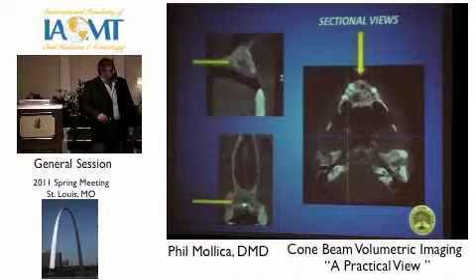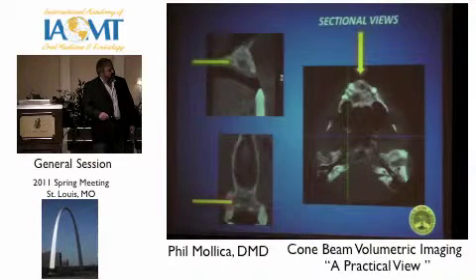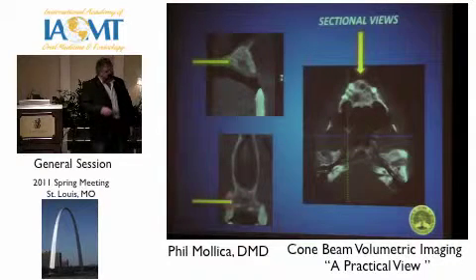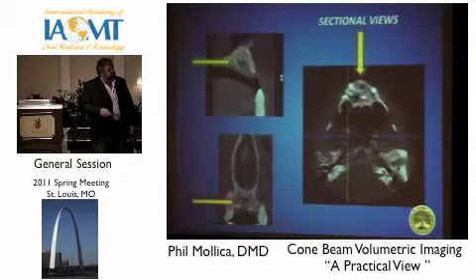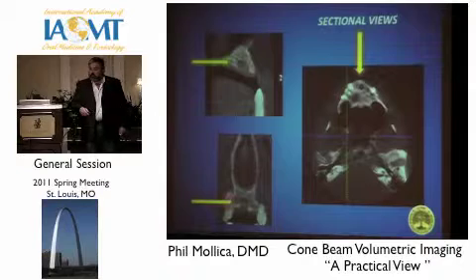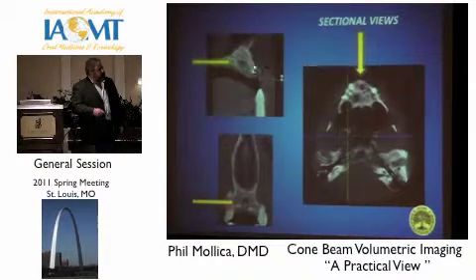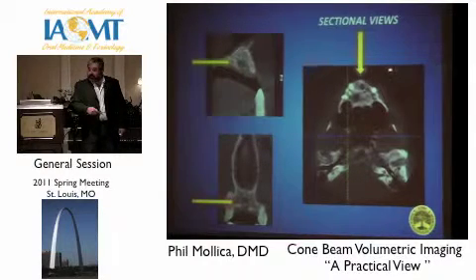We take another projection view. We can see this here. And once again, another sectional view, that part where we're coming up and down. All of a sudden, we're visualizing a hole in his head. So the traditional radiology was showing, well, it looks pretty good. But as we go through sectional views, wow, this is kind of sticking out.